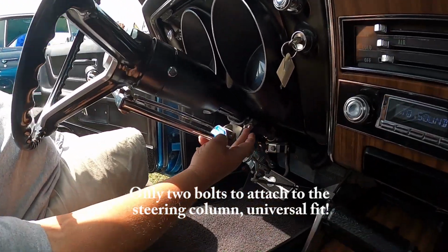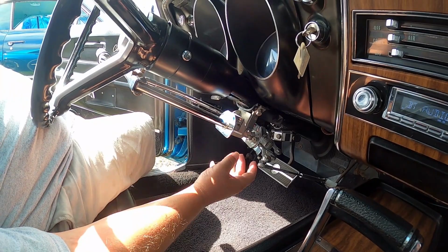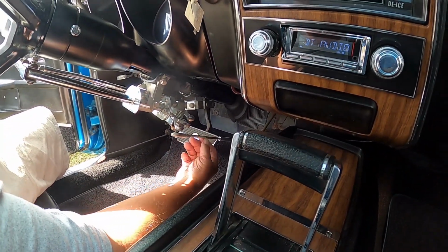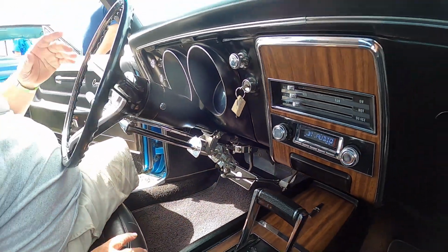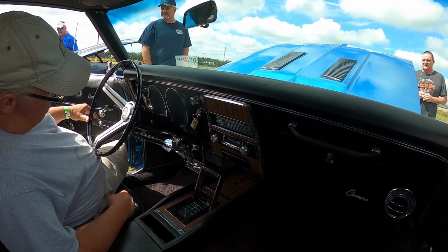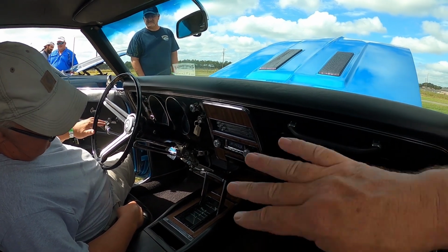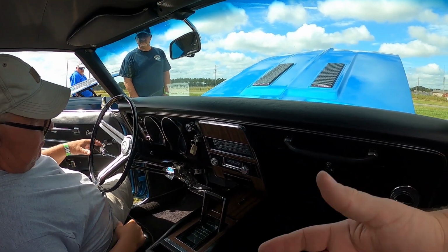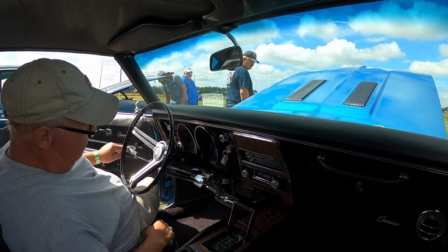That's all it takes to hook it up. And then there's all kinds of adjustments where this goes in and out. You can lengthen the gas in or out, threaded rod. Same with the brake. Everything's adjustable. Now you just go down to the gas. Oh, cool. And then for the brake, you're just pushing down. So basically one hand on the transmission, the steering, and in one hand the gas and the brake.